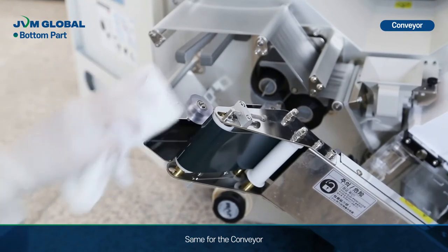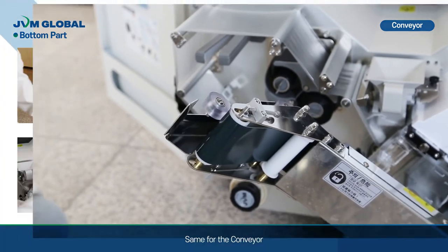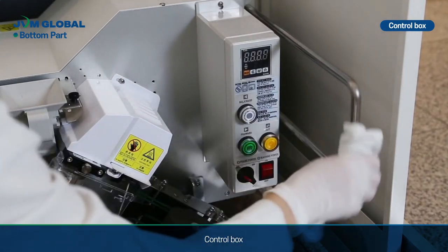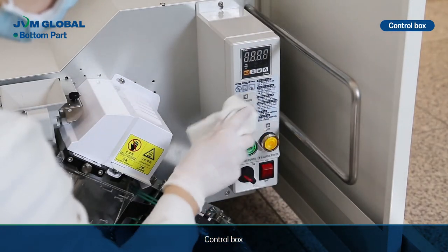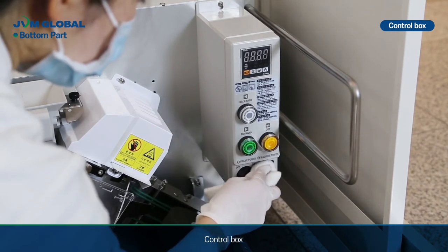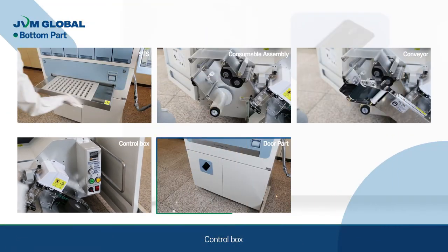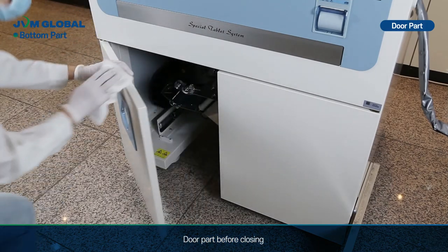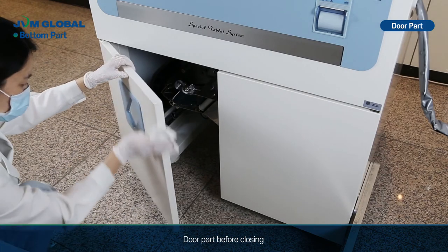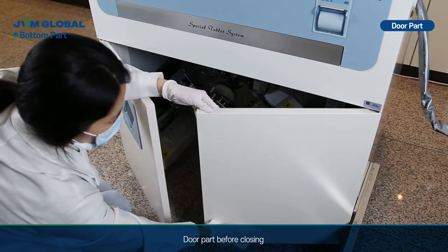Same for the conveyor. Clean the control box. Wipe the door part before closing.